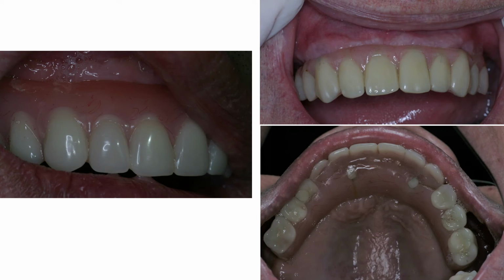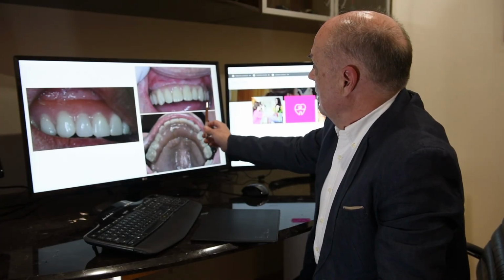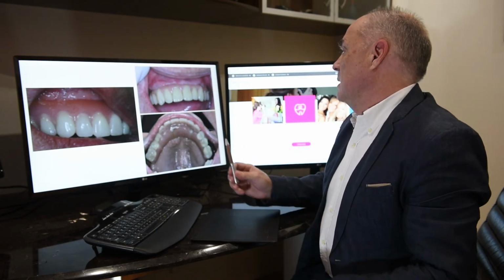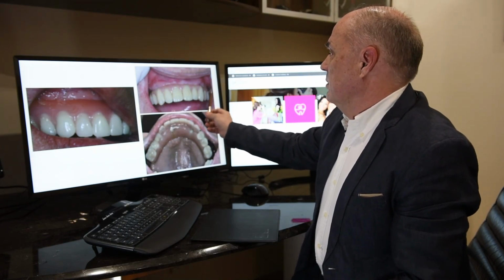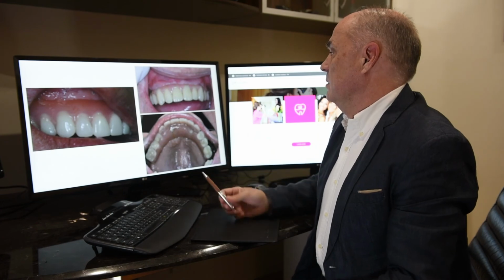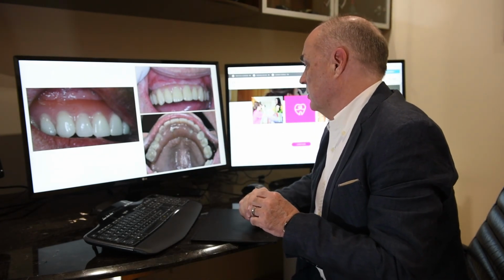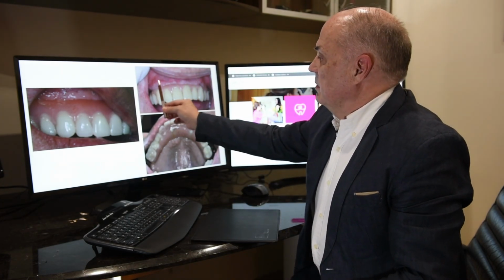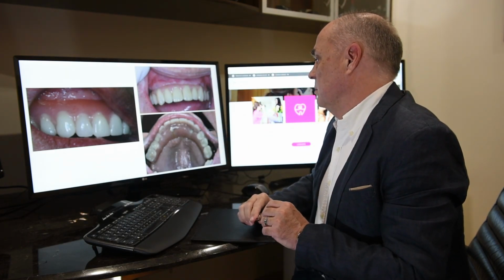So this is one that was done in another practice some distance away. This is one that we did. Now, we did this case, we did an all-on-4, and we did this in 2 hours. The surgery literally took 2 hours. The provisional was pre-made, we adapted this back, and that's designed to last 6 months. It wasn't presented to the patient as a permanent solution, but as a provisional solution. And the way I tend to operate is to make a provisional within a couple of hours, and then go back and adapt and fine-tune the tooth position.